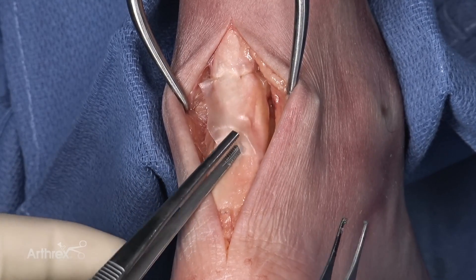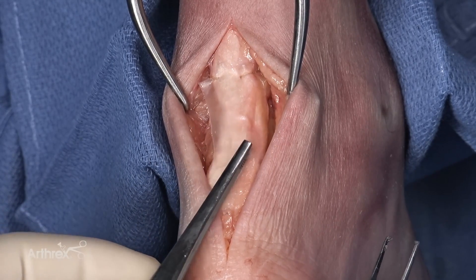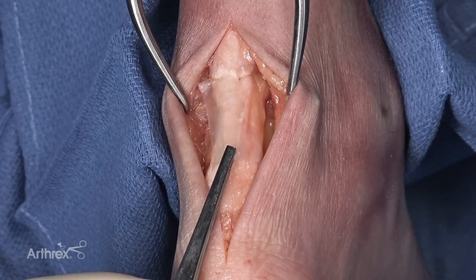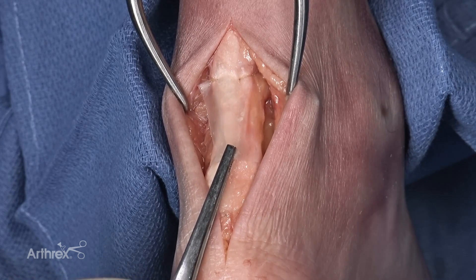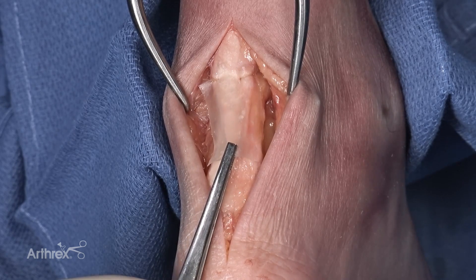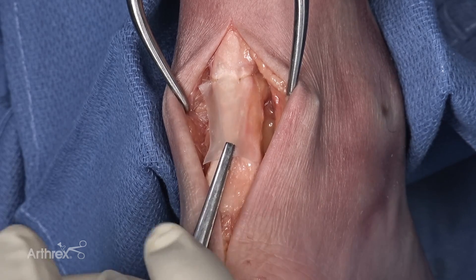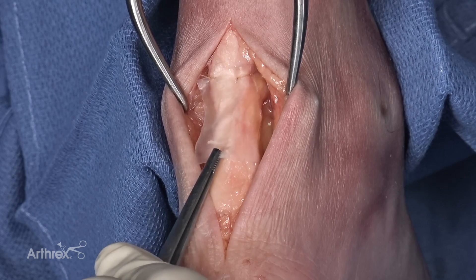Now that my temporary fixation has been performed, your surgical assistant can utilize a forcep to hold the base of the scaffold under tension to assist in your repair. Or if you feel like you've got enough stability, you do not need to utilize this step. In this particular repair, we're going to utilize a number two fiber wire and do a hybrid modification of a dual running interlock repair to amalgamate our scaffold down to our tendon. One of the keys to a successful outcome is making sure that there's no friction between our scaffold and our tendon.